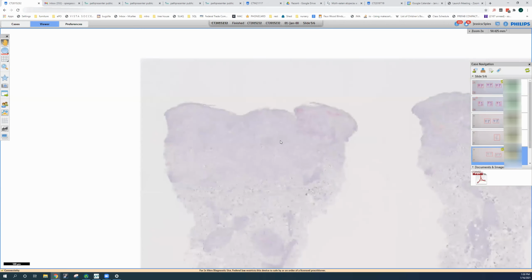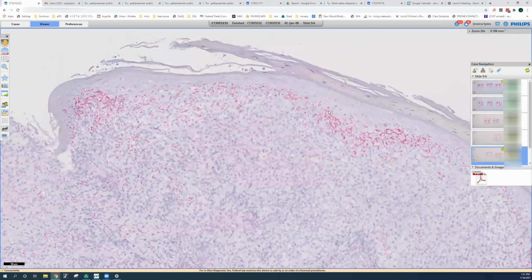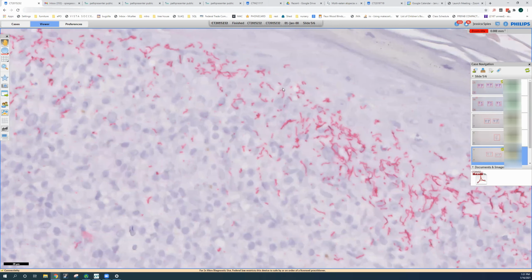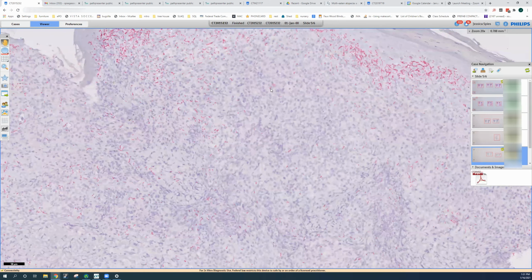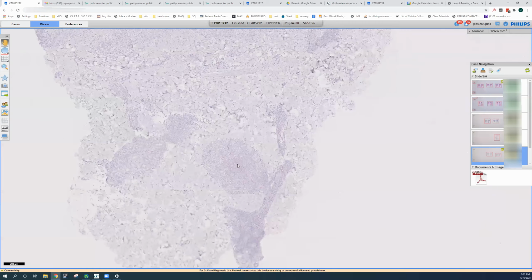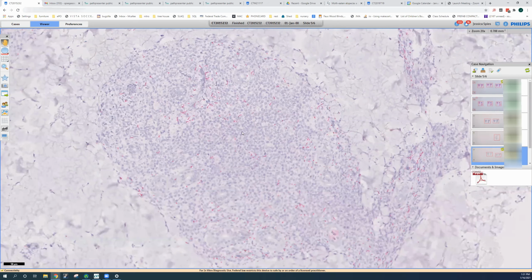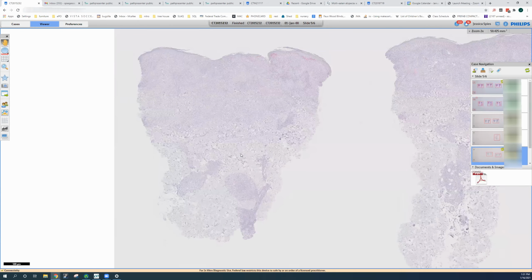This is another just beautiful spirochete stain immunohistochemistry, and you can see here, just like our condyloma lata, all of these curved spiral organisms, and they can be present anywhere in secondary syphilis, and typically in the epidermis, and also in the dermis, but they can be in the deep dermis. Let's look around and see if we have any. Yes, boy, this is an incredible case, actually. Look at all this. So you can see it in secondary syphilis, the rash of secondary syphilis.